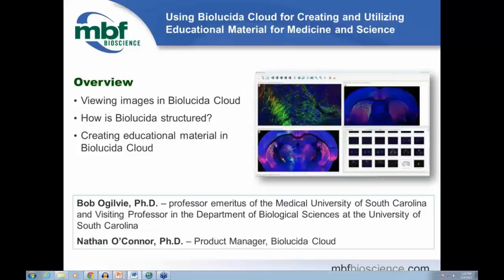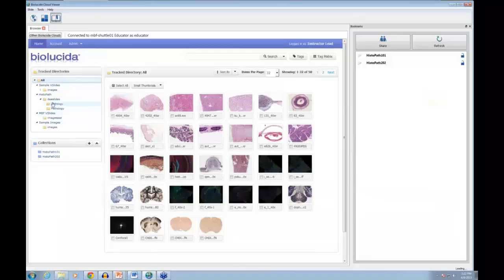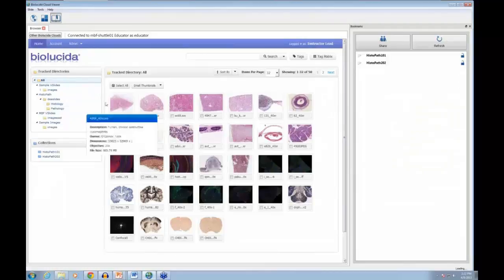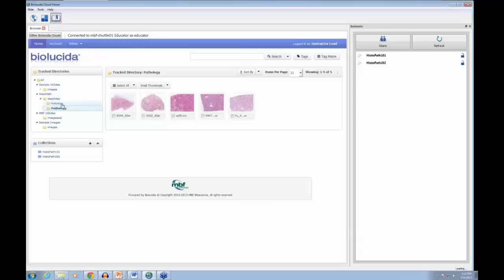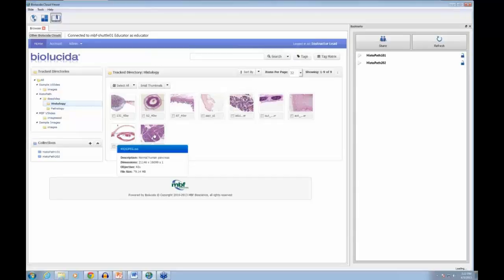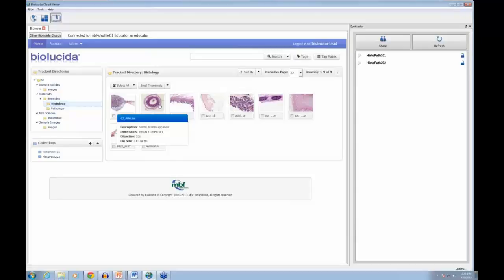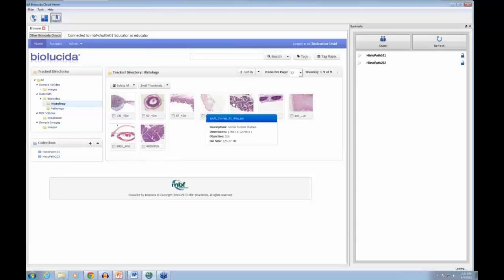Let's get started. As an educator, when you start up Biolucida you'll see a series of thumbnails corresponding to the directories on your server. Clicking on those directories navigates through your Biolucida server. If you have nested subdirectories, you'll see that exact structure here. You navigate to the slide you want and then click on its thumbnail.